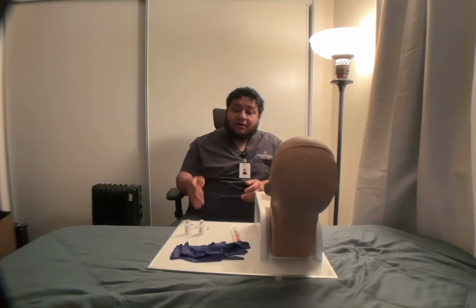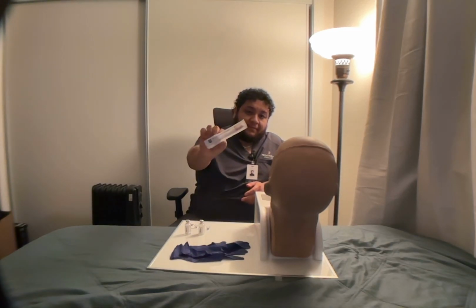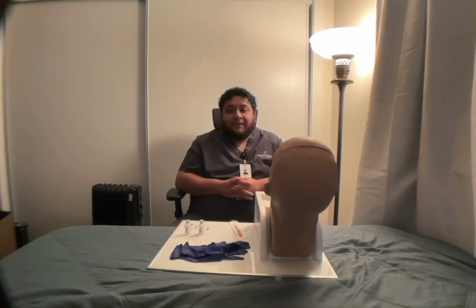I have gloves, medication vials, alcohol swabs, and a 1 milliliter insulin syringe, which is this one. To start the video off, I'm going to verify the healthcare provider's orders, and then verify the 6 rights of medication administration: right patient, right drug, right dose, right route, right time, and right documentation.